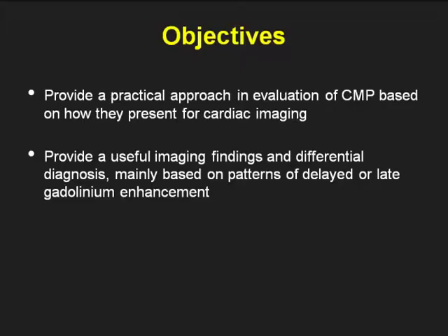My objectives for this lecture are to provide a practical approach and evaluation of cardiomyopathies based on how they present for cardiac imaging, and based on the pattern of delayed enhancement, narrow down the cause, putting that in conjunction with the various morphologic findings and function, which may be evaluated by echocardiography or by CT or MR.